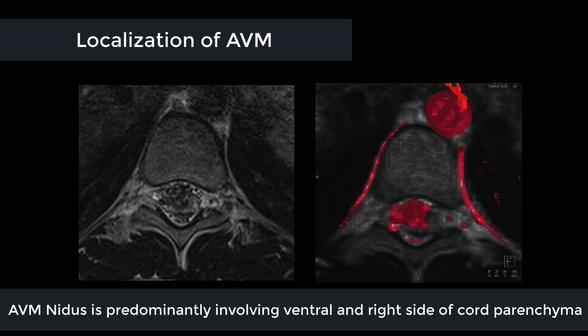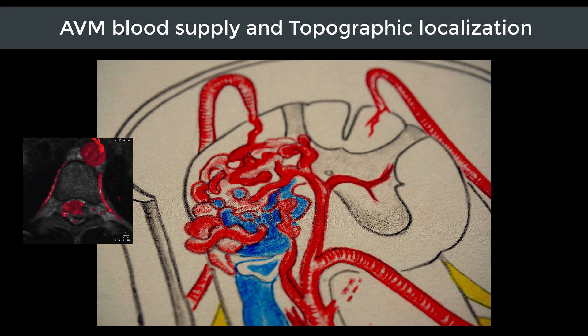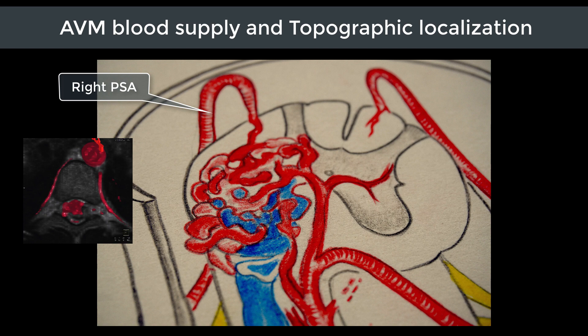In this particular case, the AVM has involved the ventral portion of the cord, more on the right side, with sparing of the left dorsolateral aspect. Therefore, in this case the AVM is predominantly supplied by the anterior spinal artery and is also supplied by the right posterior spinal artery. As the left dorsolateral aspect of the cord is spared and uninvolved by the AVM, the left posterior spinal artery is not supplying the AVM.